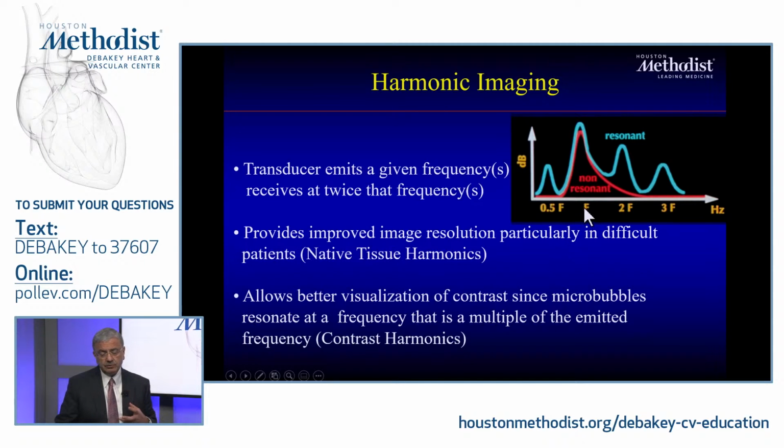And if you hit a certain object with that frequency, it may emit multiples of that, or even a subfrequency of it. Your best example in real life is if you play a metal instrument, a string instrument, a guitar or a piano. If you hit it very hard, it will send, besides its own frequency, a multiple of it, making noises like this, if you hit it hard.